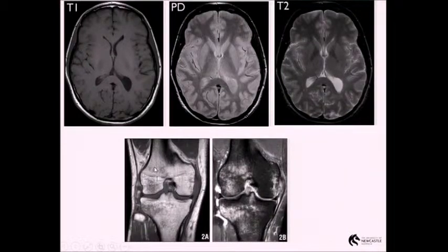And again, down here in a knee image, so here's our tibial plateau, our distal femur, our head of fibula. On PD weighted, we can see quite nice images of the bone. We can start to see the cartilage, the articular cartilage. Then when we look at a T2 weighted image, over here, where we've made all the fat signal disappear by selectively saturating out the fat.